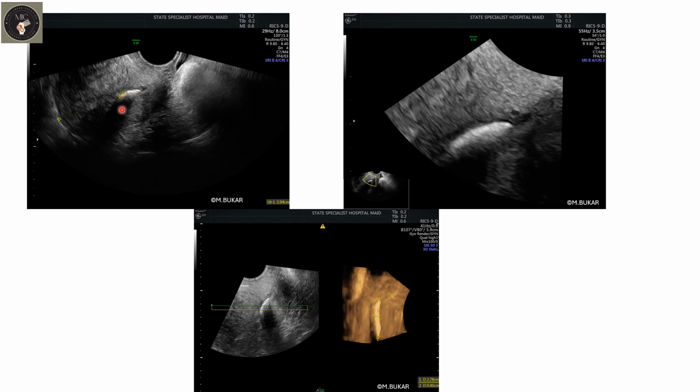area casting acoustic shadow. And the distance between the uppermost part of the lesion and the fundus of the uterus is about 4 centimeters. No wonder when you wanted to do a saline infusion sonography, the registrars could not pass the catheter, probably because this has obstructed the lower corpus.